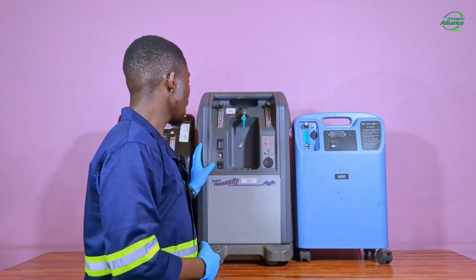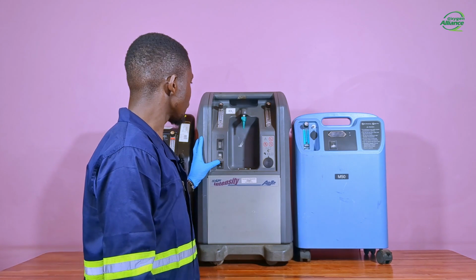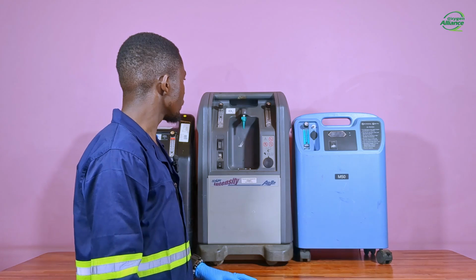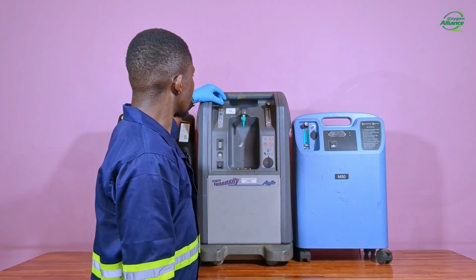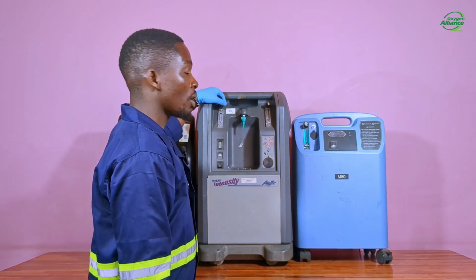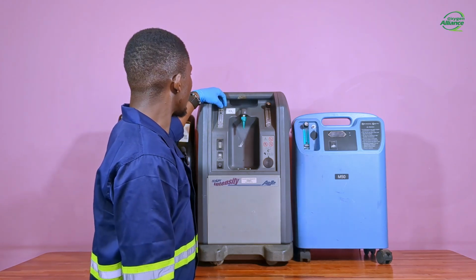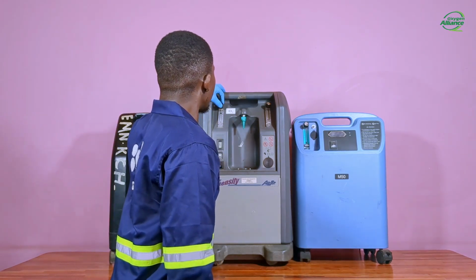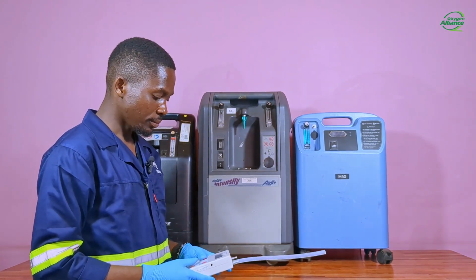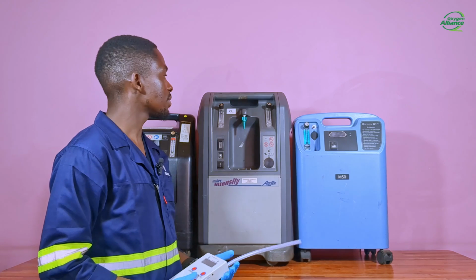I'll turn it on and then measure the oxygen purity that is coming out of the oxygen outlet. I'll set the flow rate to the maximum. I'll then wait for a few minutes for the oxygen purity to stabilize.